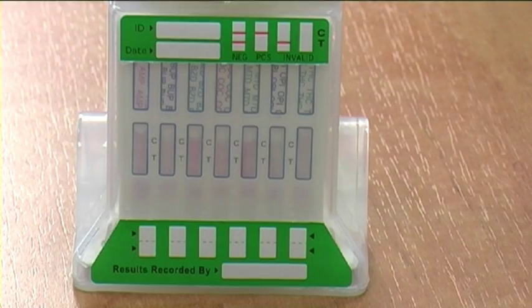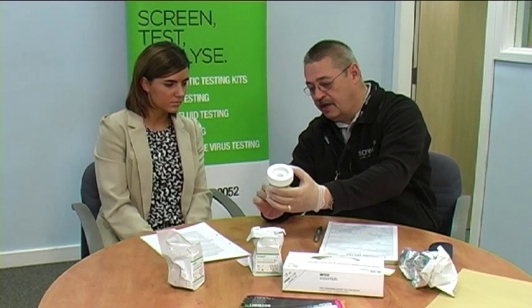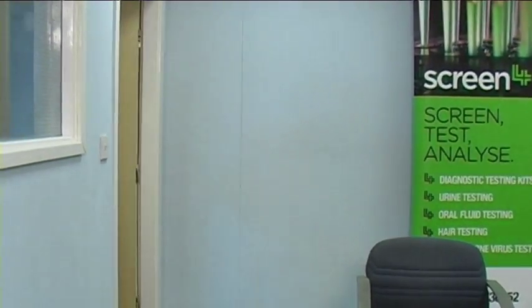A negative result is interpreted as soon as the lines appear adjacent to the relevant drug groups. We've got the lines all across there, and that's a negative result. At this point, if the test was negative, the test is complete and the donor may leave.